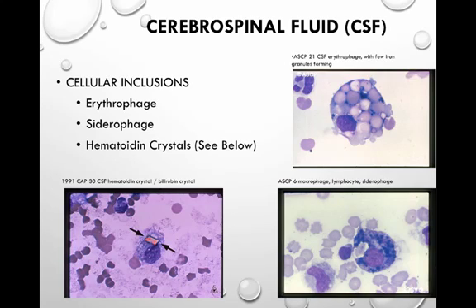Macrophages, by definition, are big eaters, and they are differentiated monocytes. That is, they are the result of a changed monocyte. So both monocytes and macrophages are phagocytes. Their role is to engulf and digest cellular debris or foreign objects. A macrophage that has engulfed a red blood cell is more appropriately named an erythrophage, and we can see that in this image at the top right.